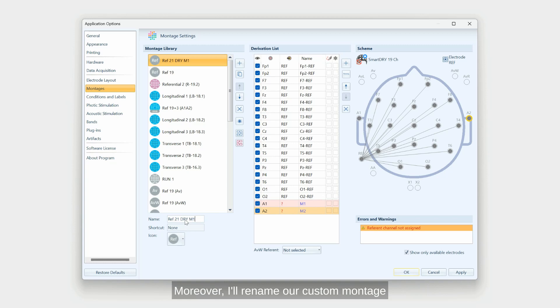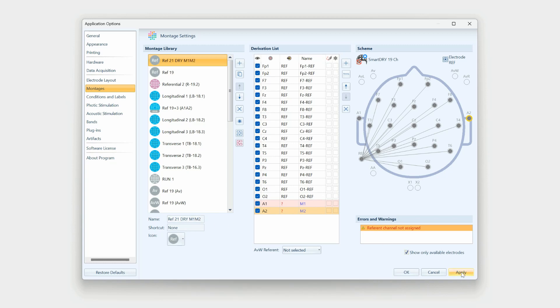Moreover, I'll rename our custom montage to make it easily recognizable. Now just click apply to save changes.